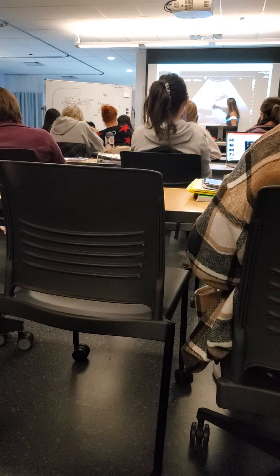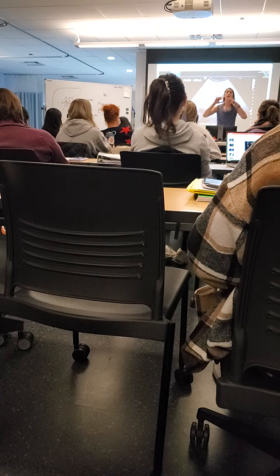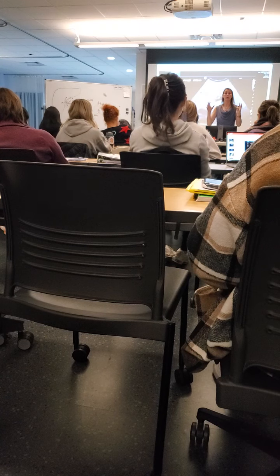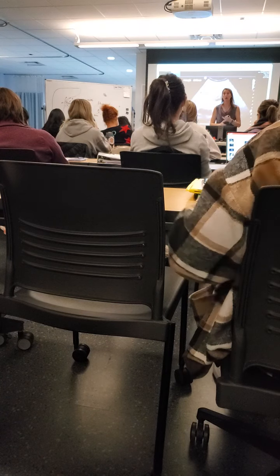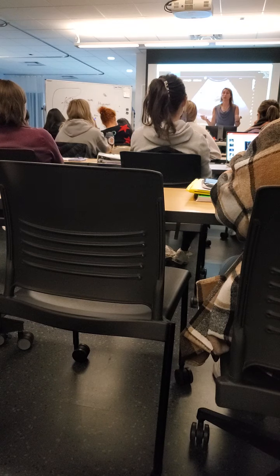Now this is a diseased gallbladder. This is cholecystitis. So gallbladder neck is somewhere here. Fundus is down here, and you can see just how thick that gets. Not only will it get homogeneously thickened, but sometimes it can get inhomogeneously thickened. We can have either increased vascularity or fluid in the wall. So we put color on to know for sure, but we can either have hyperemia or wall edema. So fluid collecting in that wall, or we've got increased blood flow because it's an infection, right? Itis, cholecystitis.